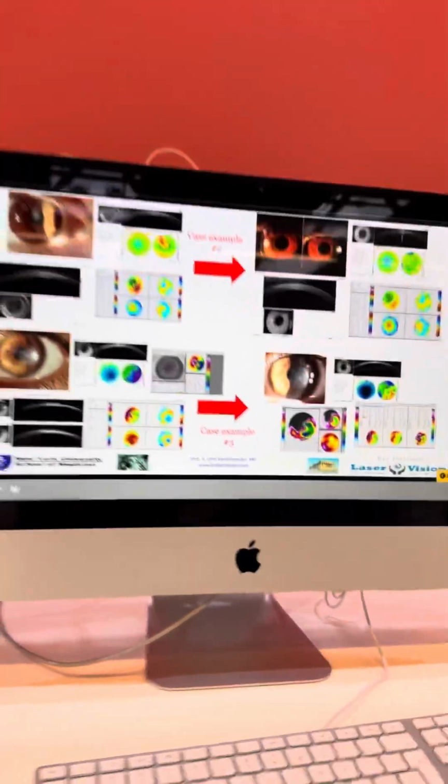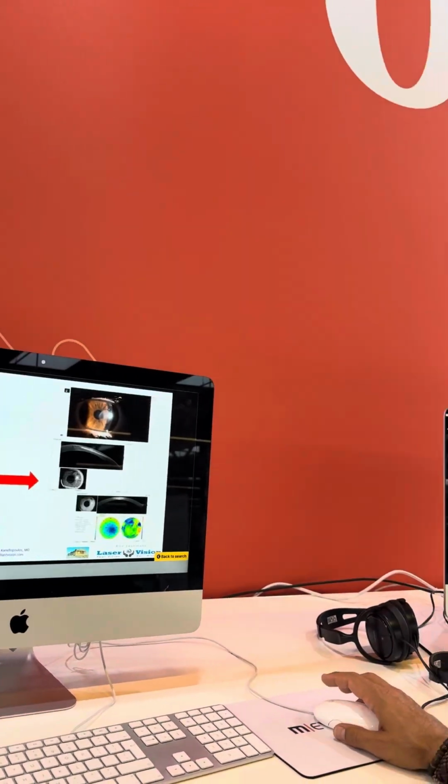So we're seeing here some of the caveats of employing customized treatments in very irregular eyes, in this instance severe cornea scars, most of them as a result of infectious keratitis, again underlining the fact that contact lens wear is more dangerous than laser vision correction today. So we can't push people to have laser vision correction, but at least have to be aware. And this is a way how to manage some of these very severe complications.